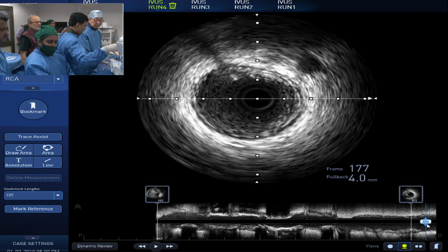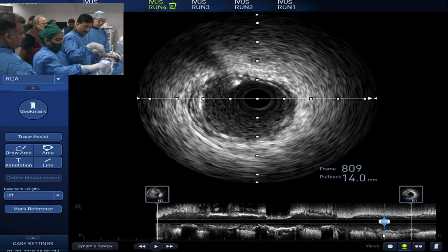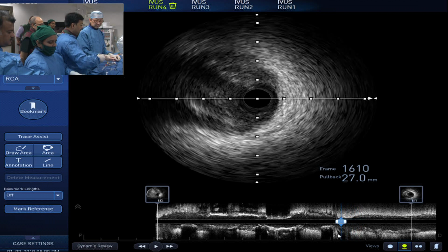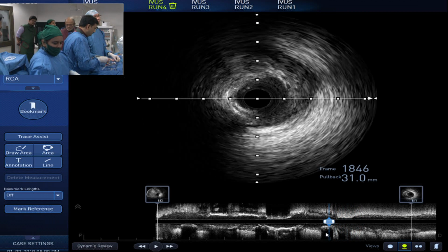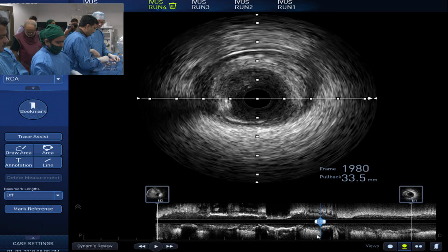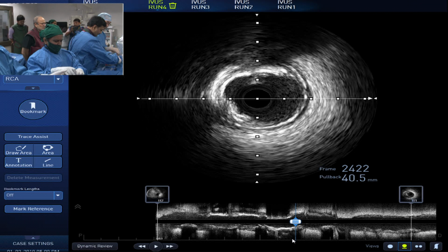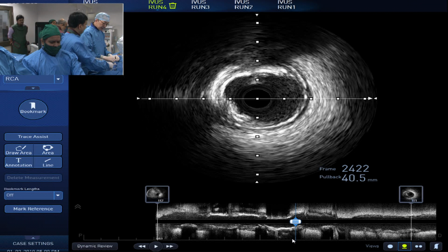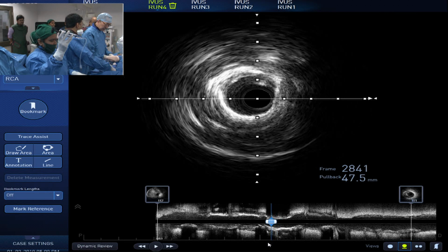Mamas, can you describe how long this whole process of the lithotripsy takes? How much time will it take to melt away this calcium? Each balloon, you can apply 40 pulses, and in about the first 10 pulses the lesion will expand, so it's not that long.